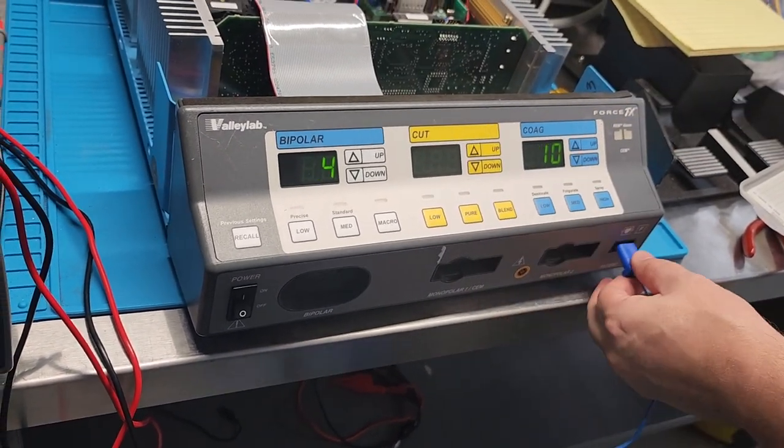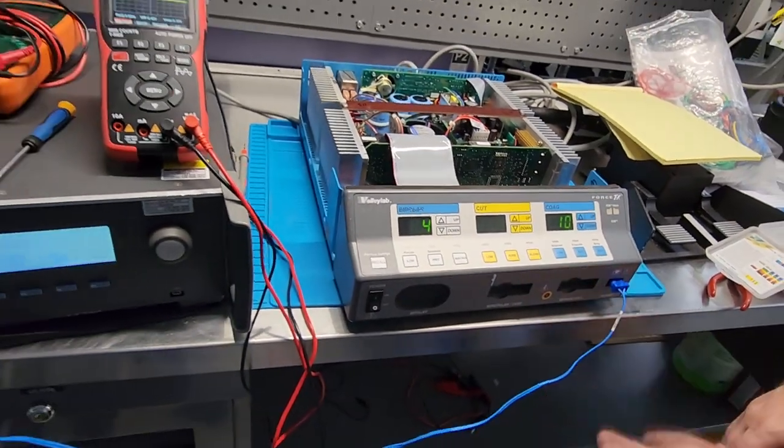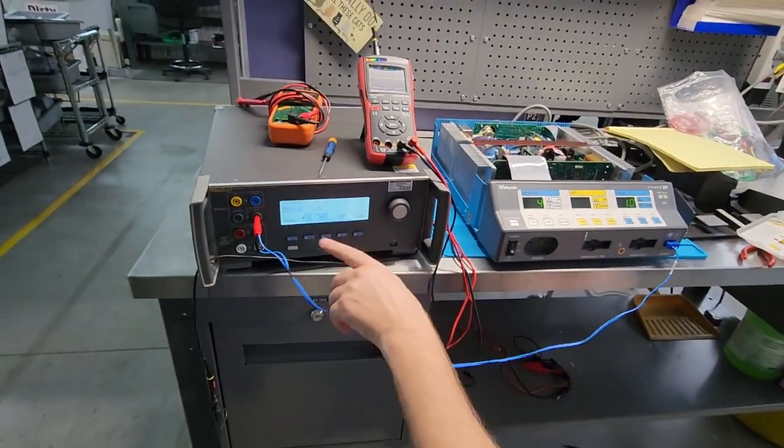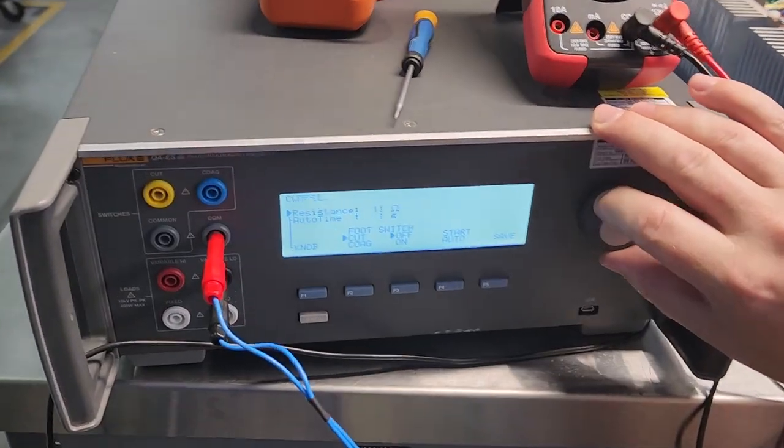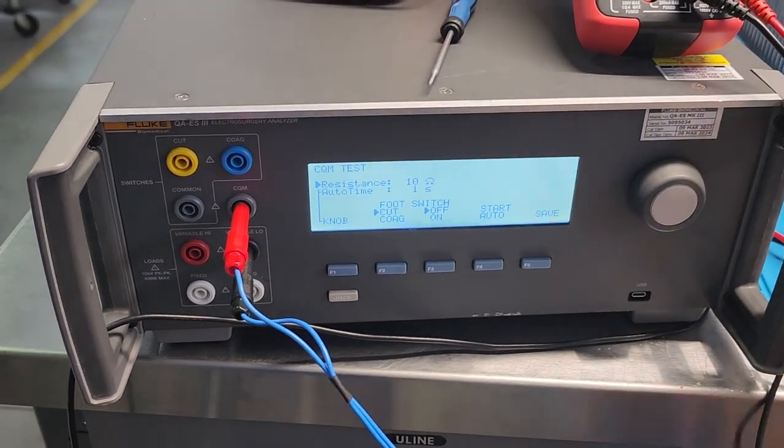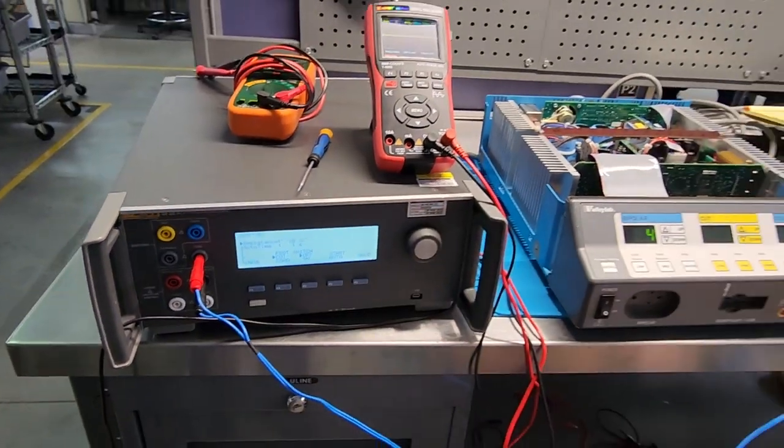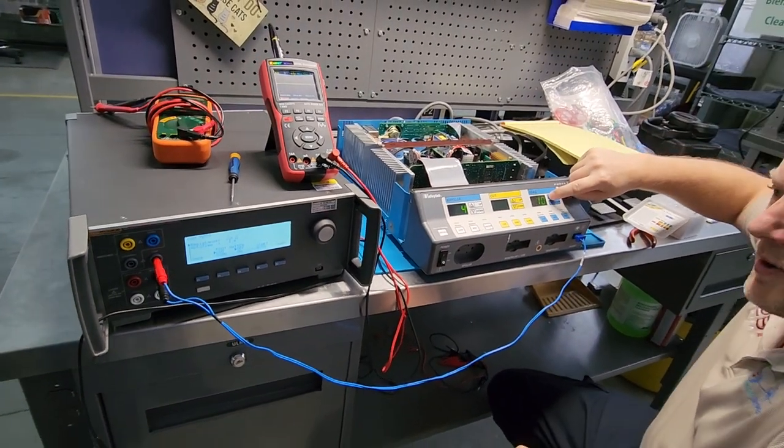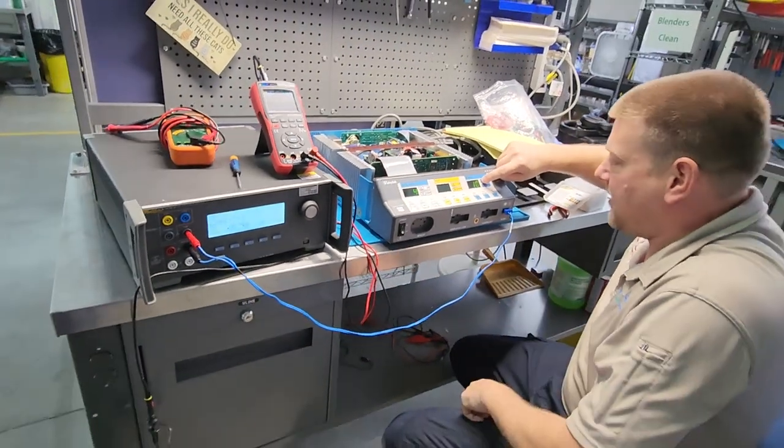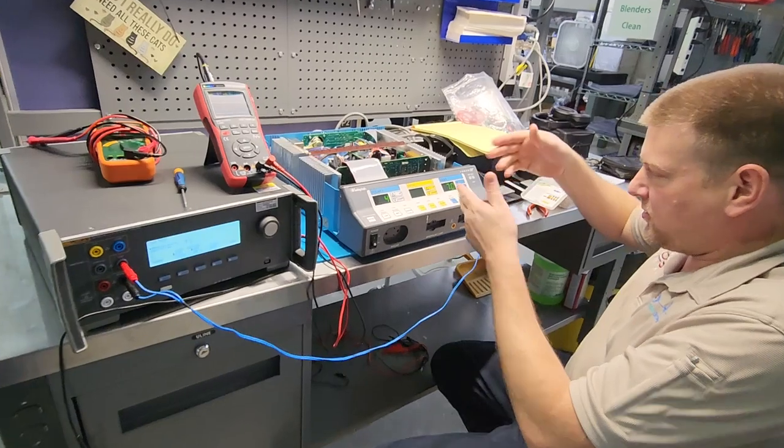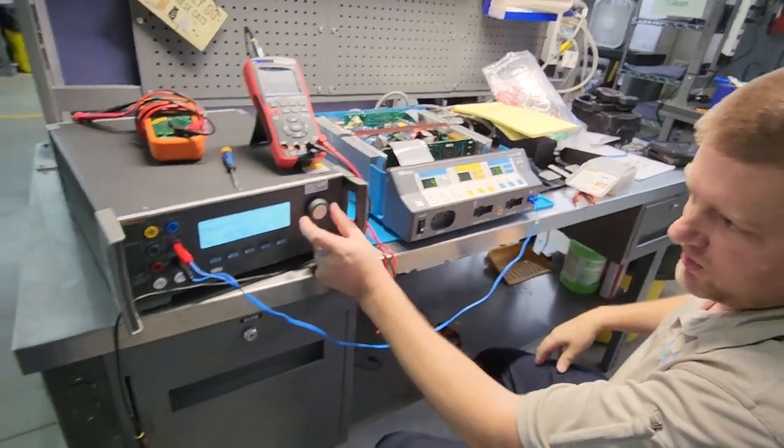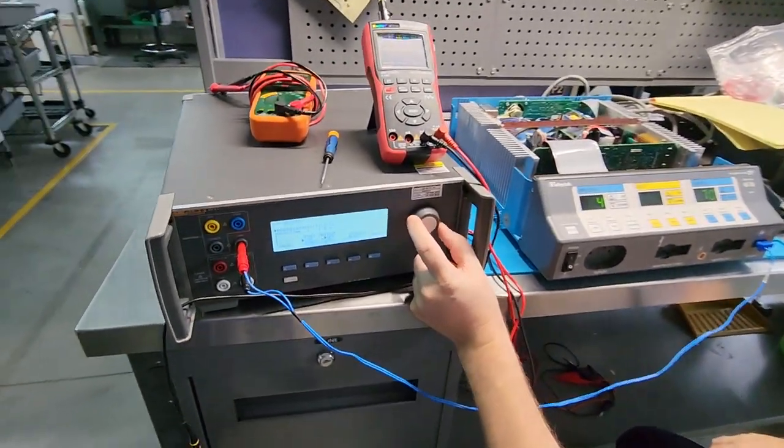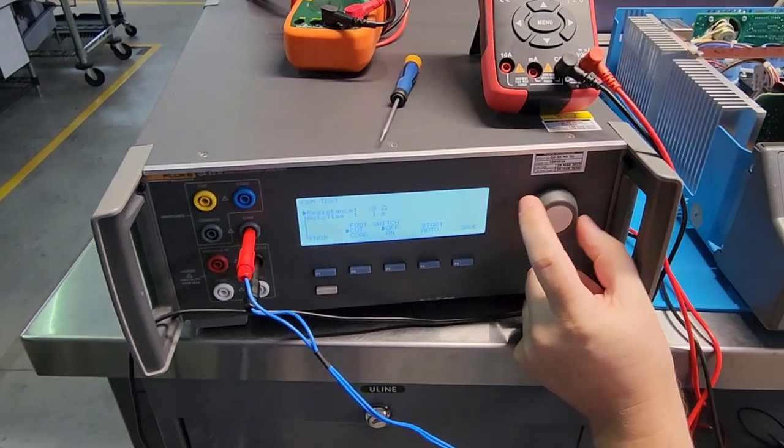Now it's asking us for 10 ohms. So we're going to plug that guy back in nice and carefully. And over here, we're going to dial in 10 ohms on our QA ES3. Then I'm going to hit the up arrow, which confirms that I am at 10 ohms. That auto sequences to the next value, which is 70 ohms. So let's go ahead and take it up to 70.